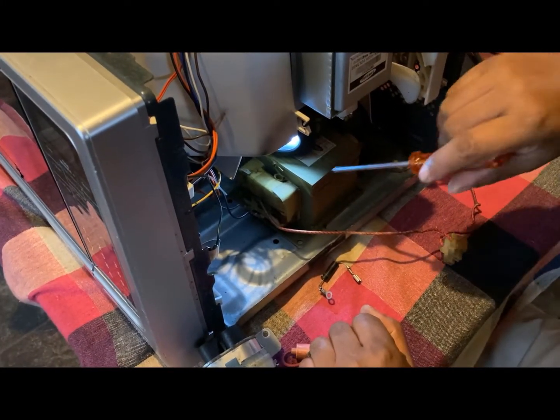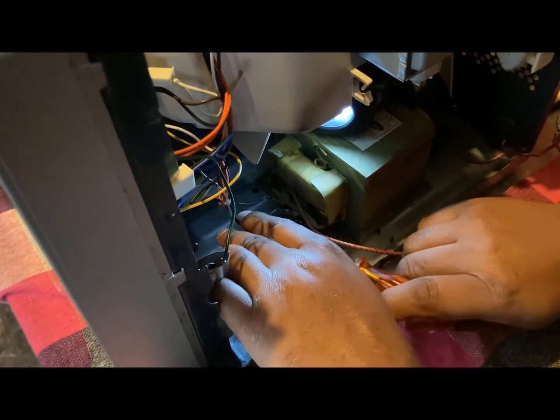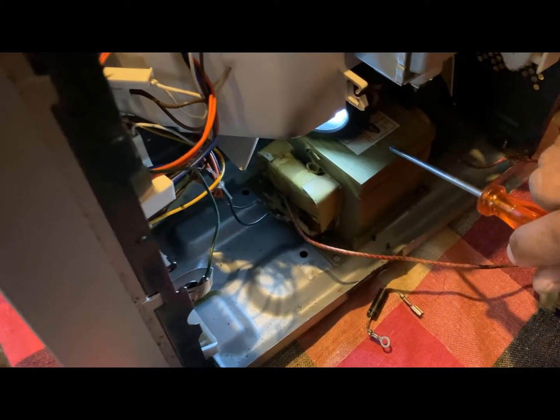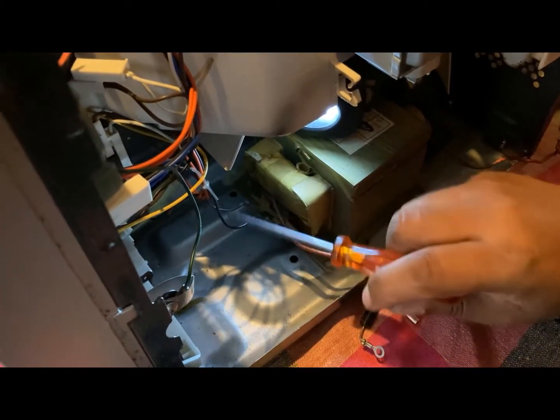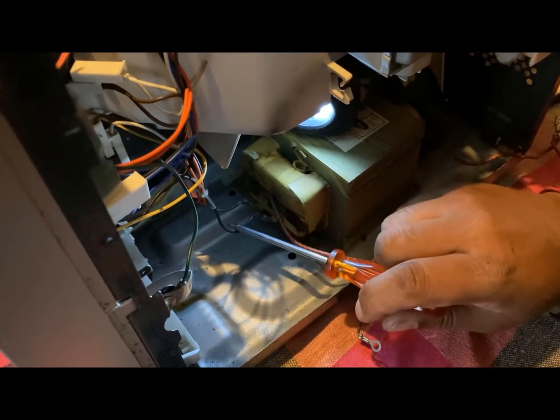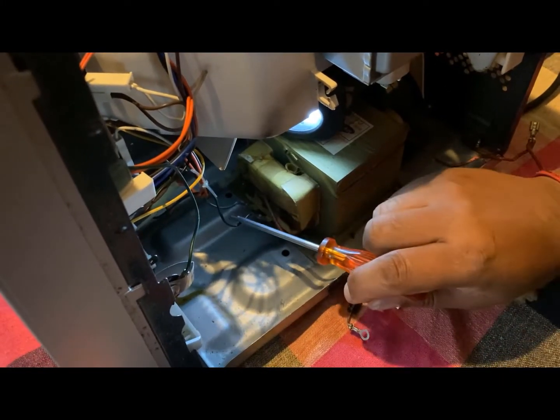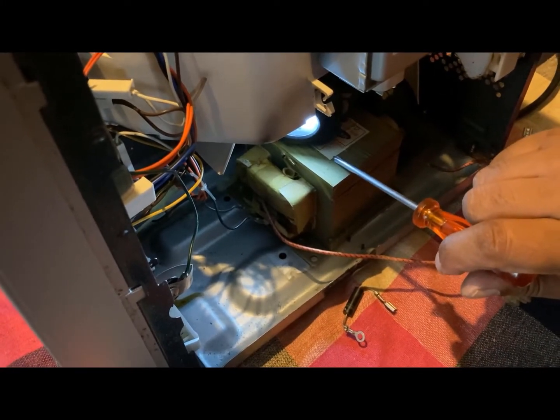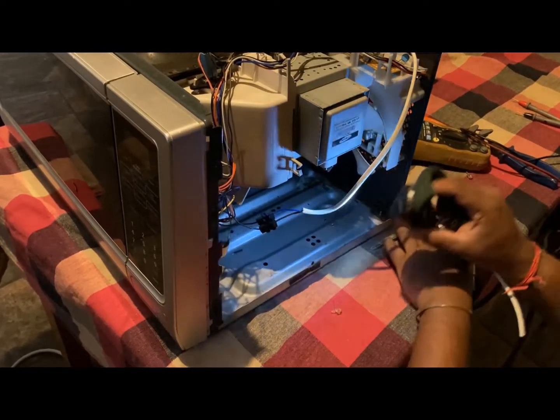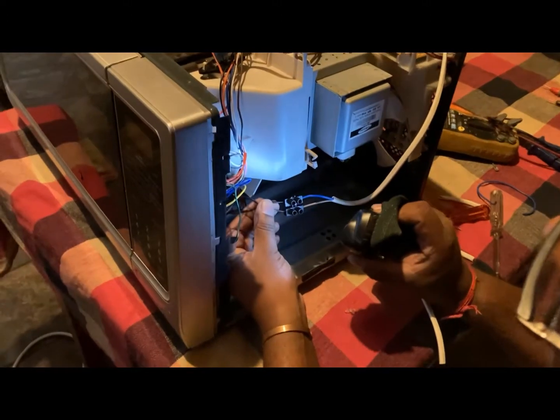And before I remove the transformer, I just want to show you the most important wires, that brown and black. This is the one that energizes the transformer. And this brown and black wire, this is what I'm going to use to connect my new light fittings. So please remember these two wires that go to your transformer. Okay, now all the parts have been removed, and just remember that brown and black wire.